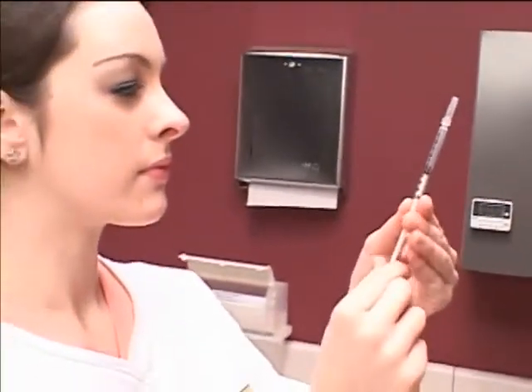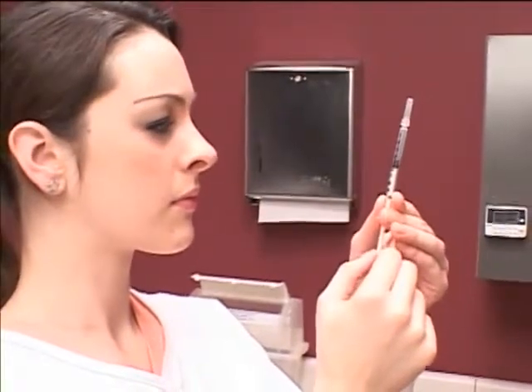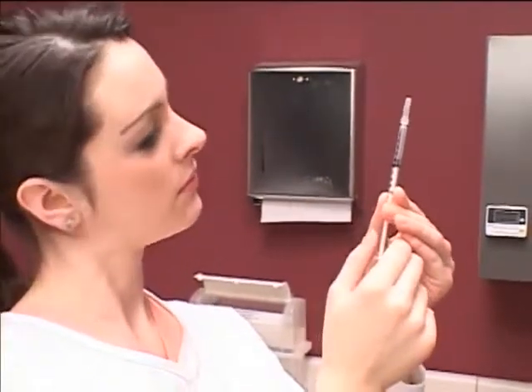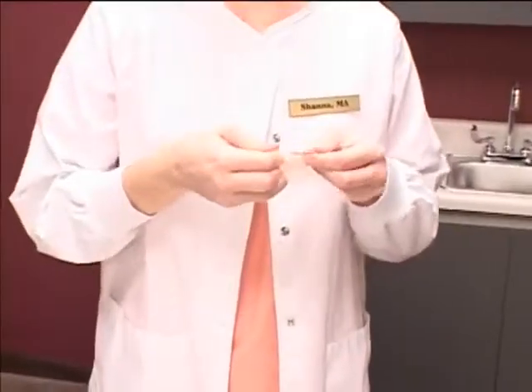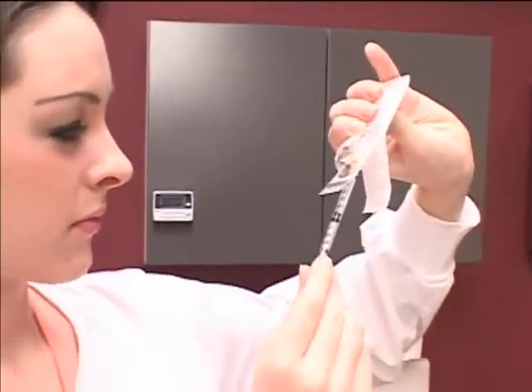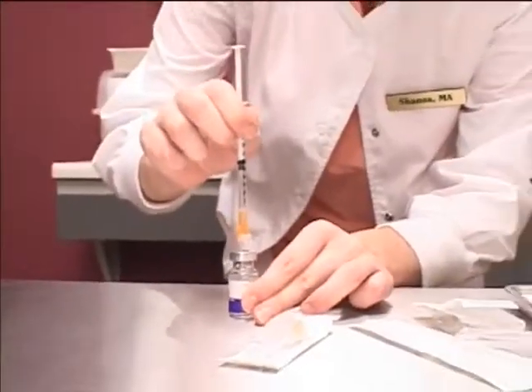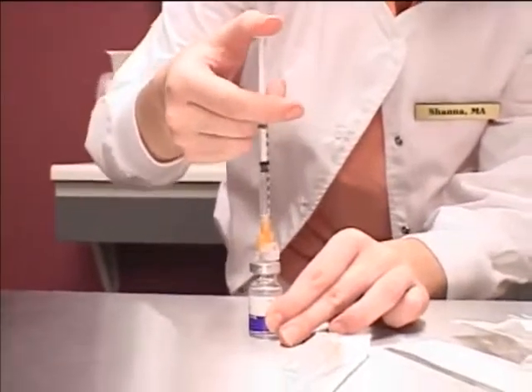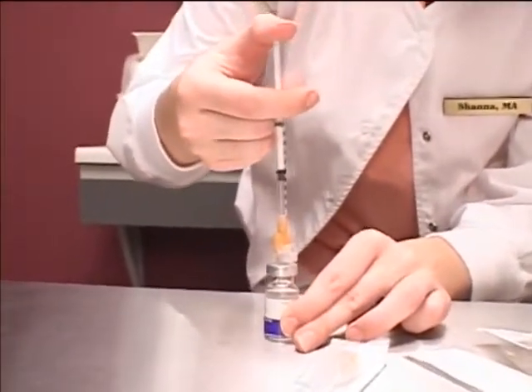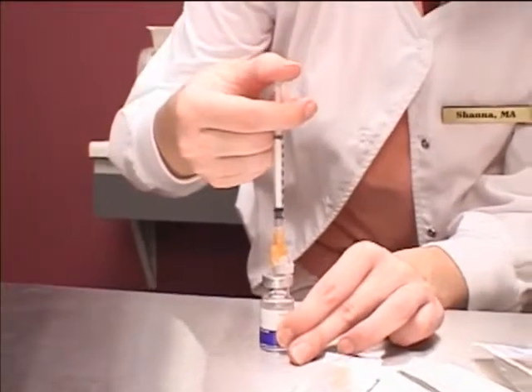While holding the syringe at eye level, pull the plunger back to fill it with air to the desired volume of medication. Being careful not to contaminate, unwrap the needle and attach the needle to the syringe. Uncap the needle and lay the cap on a clean surface. Place the needle in the center of the vial and inject the air slowly. Injecting quickly may result in air bubbles that can affect the accuracy of the withdrawn dose.